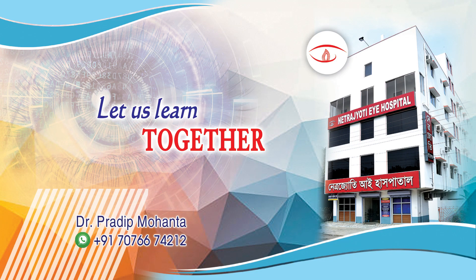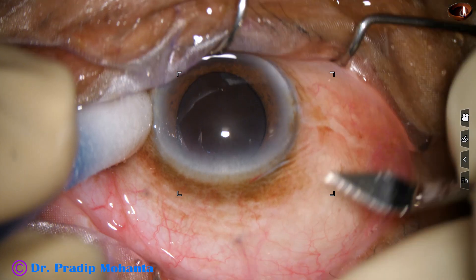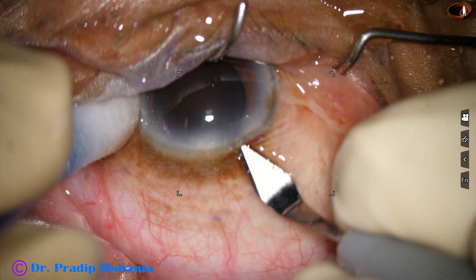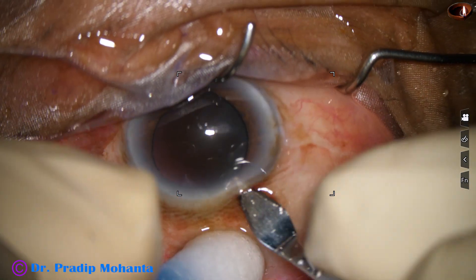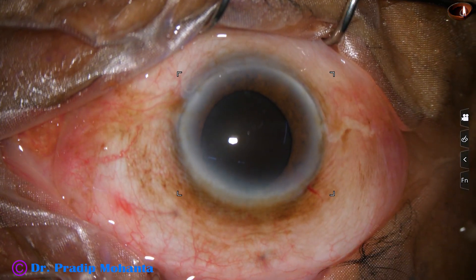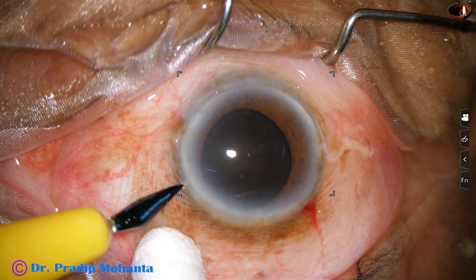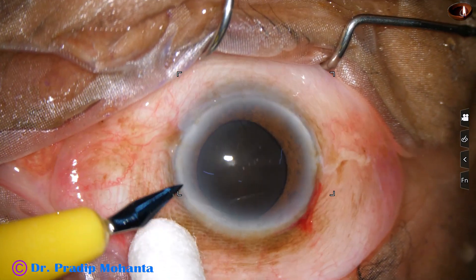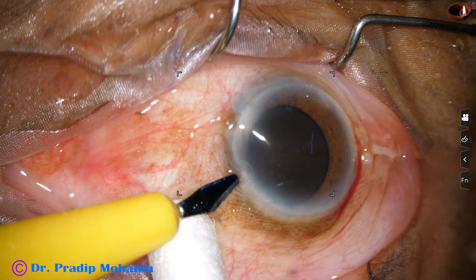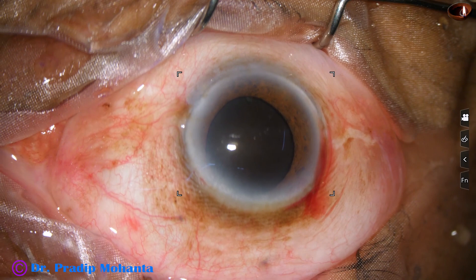Friends, welcome to my workplace for hands-on FACO and SICS training. This is a very hard cataract. You can see the black appearance of this cataract. If we say it is grade 5 nucleus sclerosis, it's not enough. In brown cataracts we say grade 5, but this is black, so it is much harder than NS grade 5. Let's observe the management of this cataract.